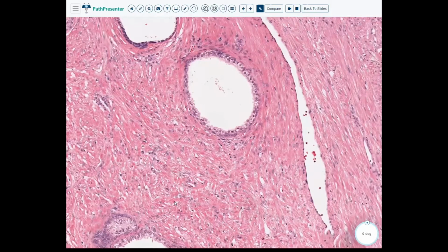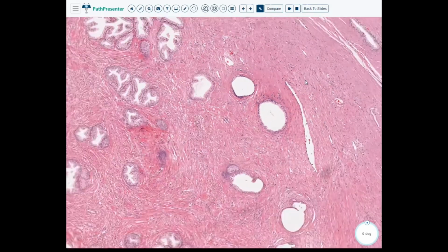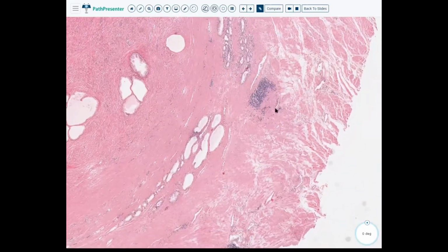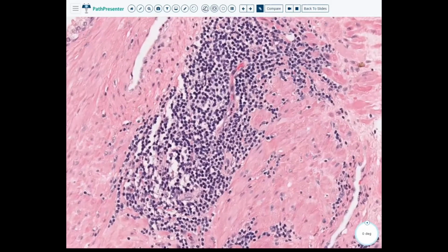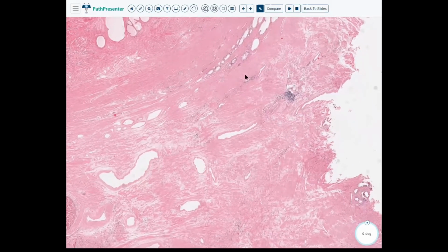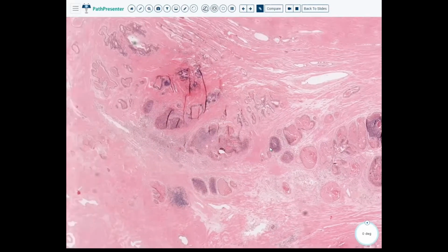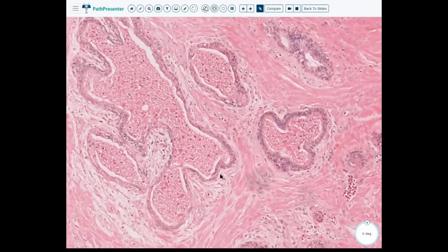In areas like this, we can see that again there's just a lot of stroma. Nothing really looks too angry, though. We're not seeing inflammatory infiltrates, which, again, the prostate, just like any other tissue, can have inflammatory reactions. Having this little bit of lymphocytic infiltrate is totally fine. We worry more if we're seeing neutrophils actually in prostate. So again, these little bits of lymphocytic cells are totally acceptable. And again, these look benign.